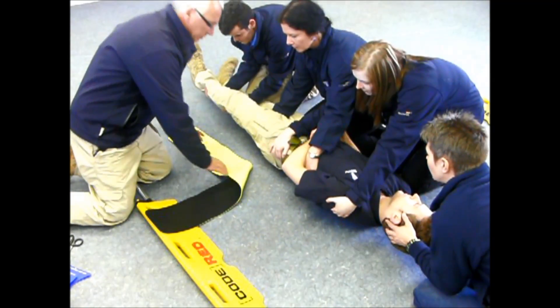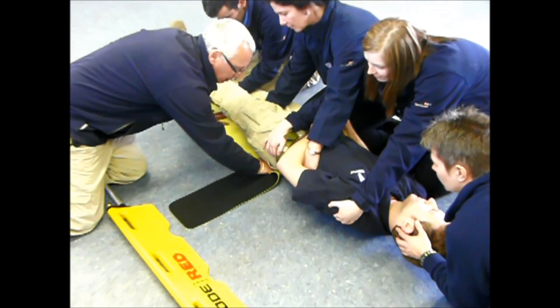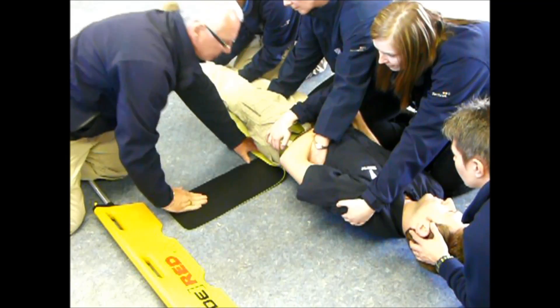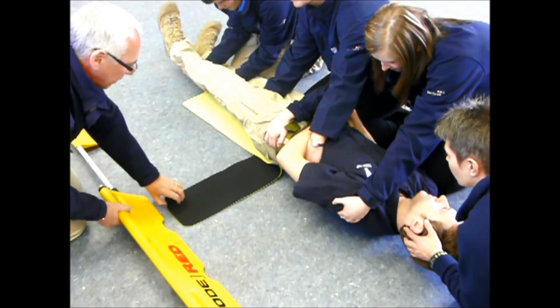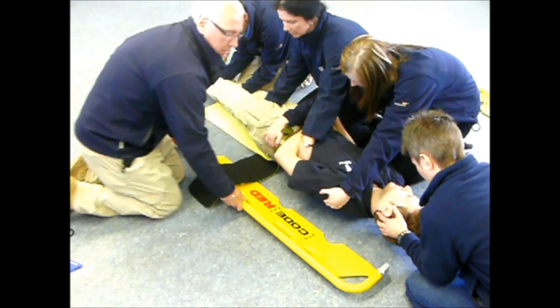Once the patient is in that position with about a 15 degree tilt, I can now slide this yellow belt to the midline, still making sure I'm in line with the greater trochanter there in the middle of the belt. Once we have that in place, I can now slide the scoop, which has been pre-measured to our patient.